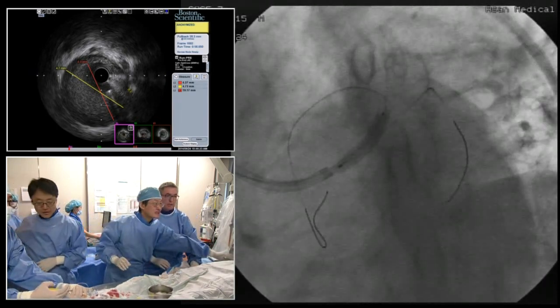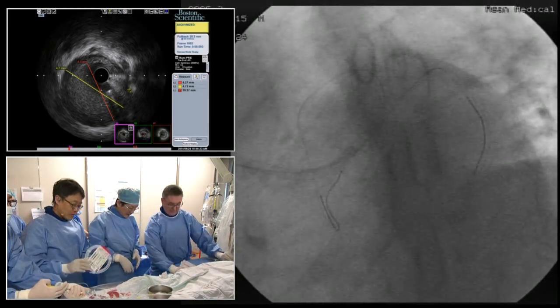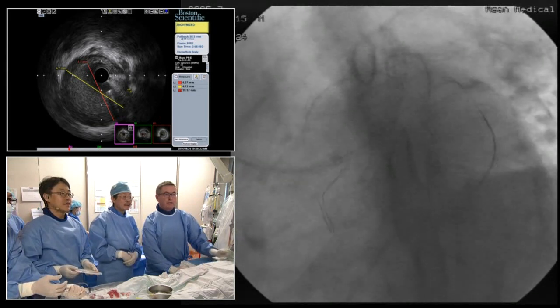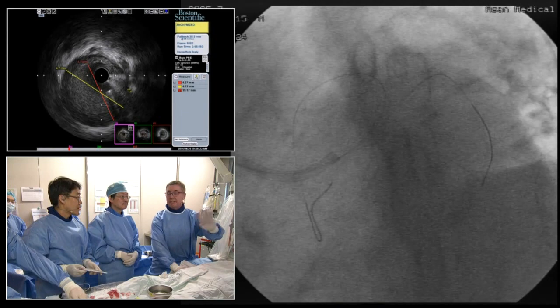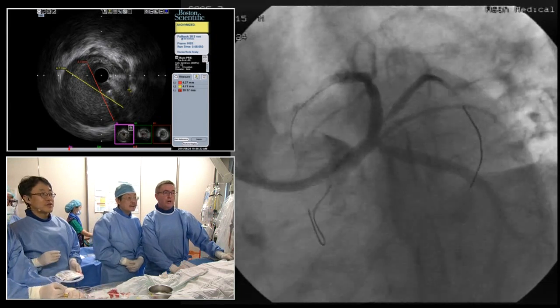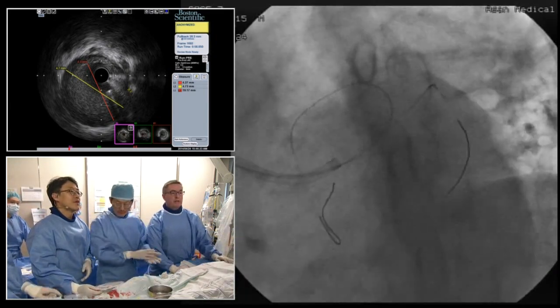So let's actually, I'll push it in. Yep, that's a bit too far. Oh, you're right on the stent. Hang on, that's too far. Right, now what I'd like you to do is give me half a second to see the stent before you put the contrast in. You ready? So wait for a second, see the stent. Beautiful, go. Okay, great. So you don't want to push the guide in too far and compress on the stent.